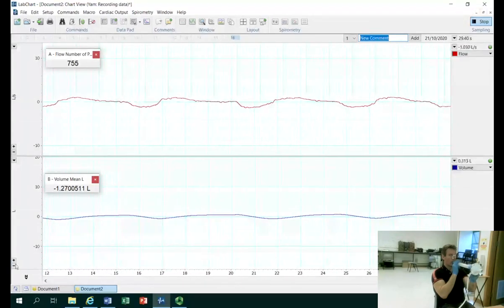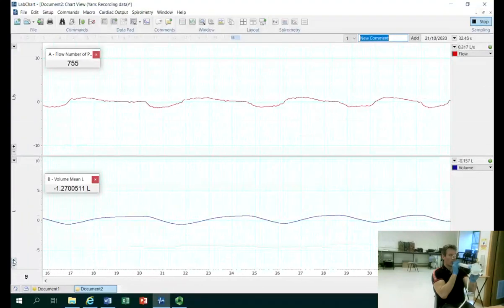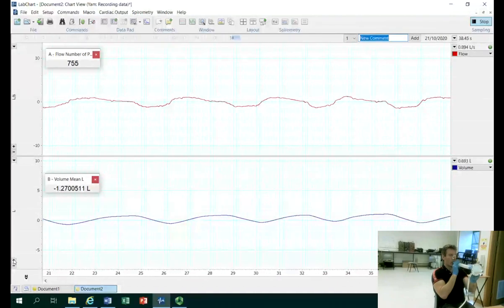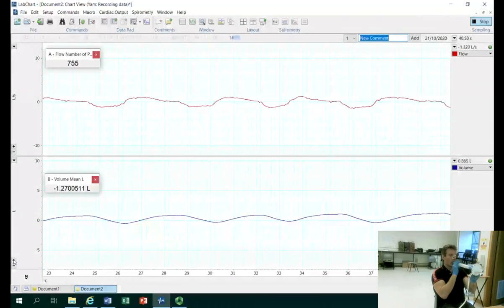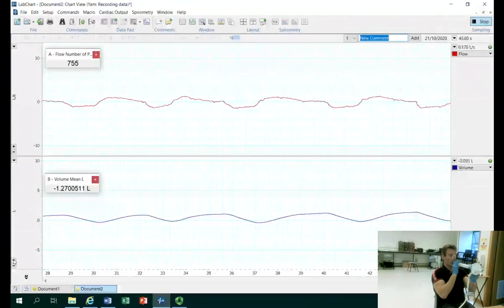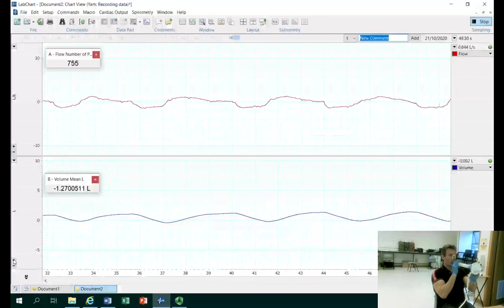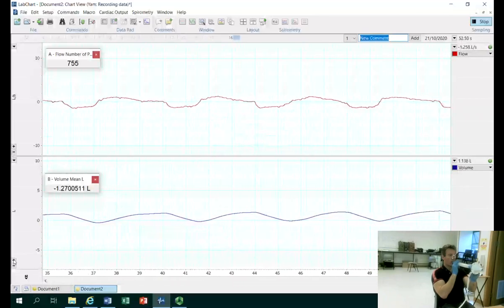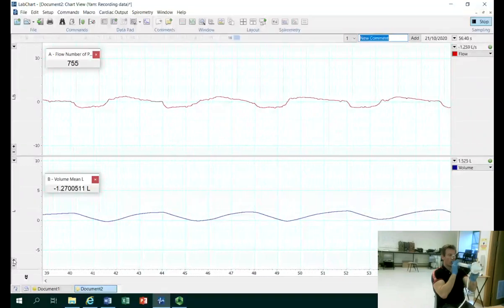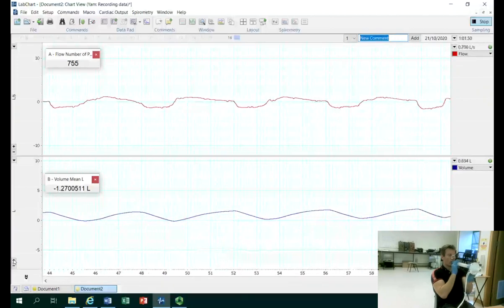Jack is getting into a normal breathing pattern. In most individuals at rest, the breathing rate will be about 12 to 15 breaths per minute. The tidal volume will be somewhere between maybe 0.5 and 1.5 litres per breath. From this we can calculate minute ventilation. Minute ventilation is equal to tidal volume multiplied by respiratory rate. For example, if the tidal volume was 1 litre and the respiratory rate was 15, the minute ventilation would be 15 litres per minute.